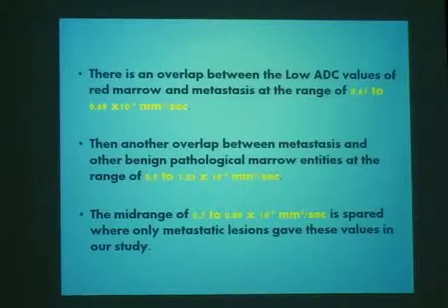I can also conclude that ADC could play a major role in the follow-up. We can consider these values a baseline. And then on follow-up, whether the patient is responding or not will be concluded through the rise or the decline in the ADC values.